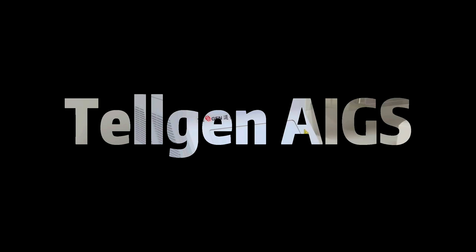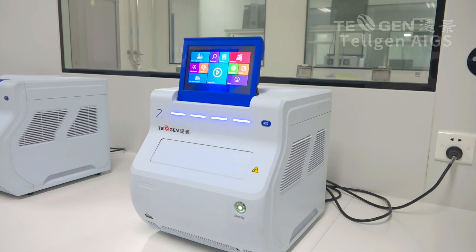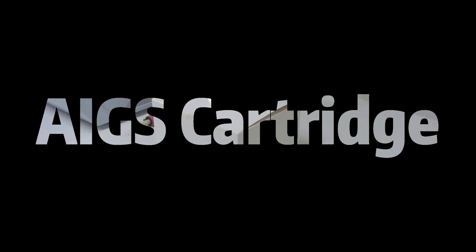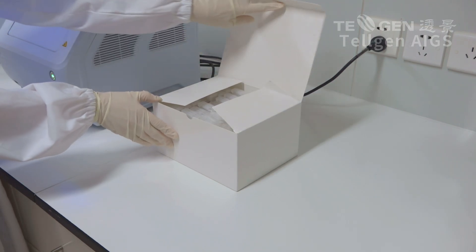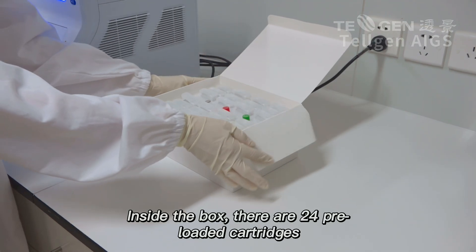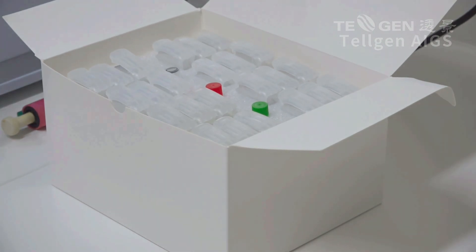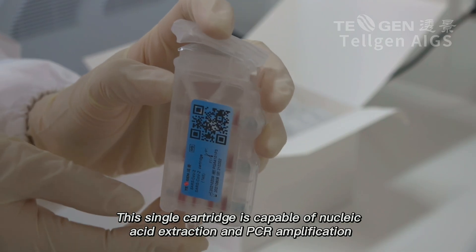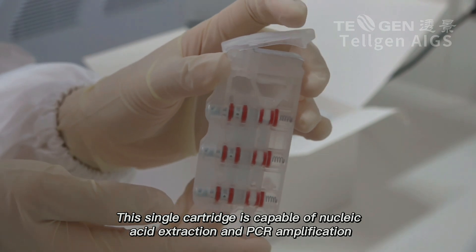Telgen AIGS. AIGS Cartridge. Inside the box, there are 24 preloaded cartridges. This single cartridge is capable of nucleic acid extraction and PCR amplification.